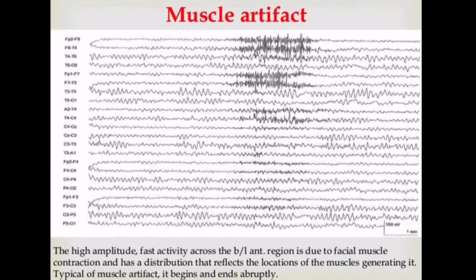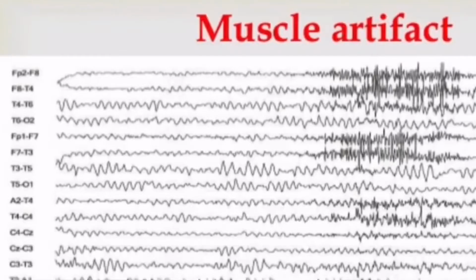In the frontal region of this EEG, at the top of the page, you're going to see what is called muscle artifact. This artifact shows up on pretty much every EEG because sometimes the patients will be a little bit tense and not everyone can be completely relaxed all the time. And people are going to move around. That's just natural. Here I zoomed in on it so you guys can see it a little bit better. That top right dark activity, that high frequency activity, that's going to be your muscle artifact.